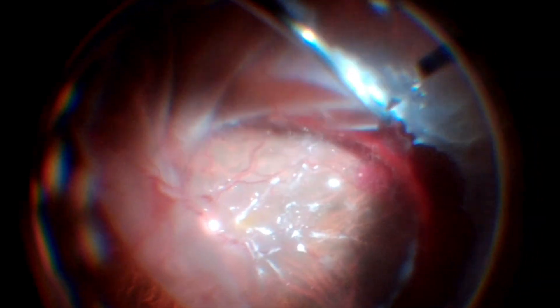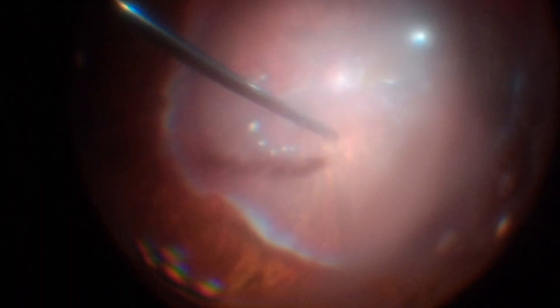While cutting the inferior retina, the surgeon performs relaxing retinotomies. The anterior retina to the retinectomy is trimmed using the vitreous cutter.